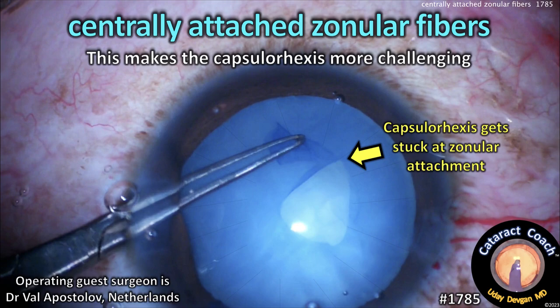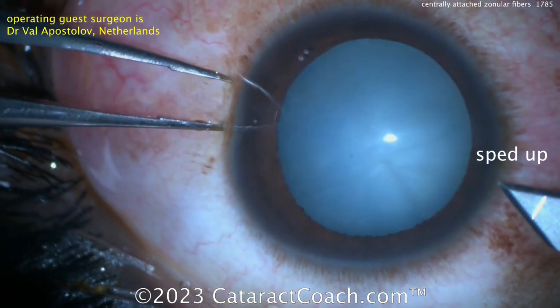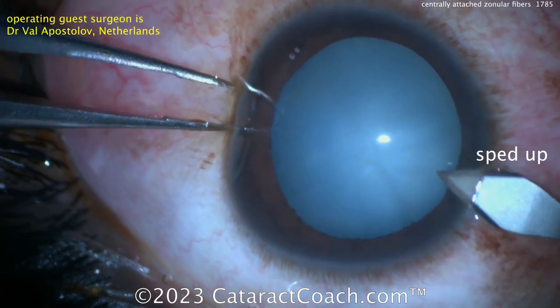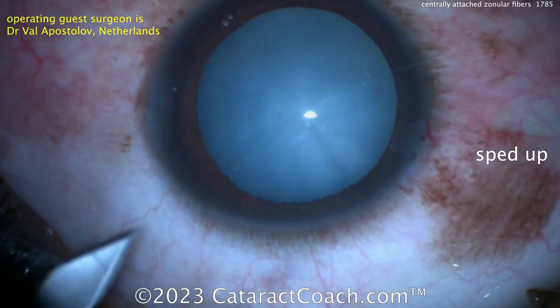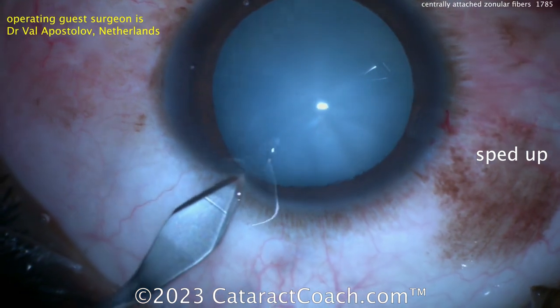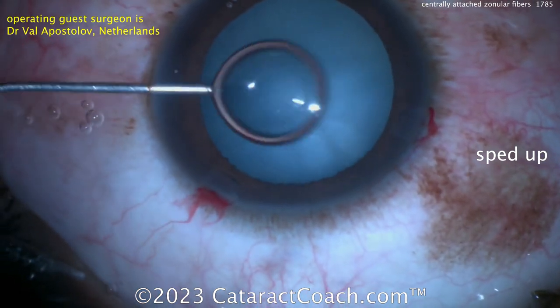CataractCoach.com. This case features centrally attached zonular fibers, which makes the capsulorhexis more challenging. You can see the capsulorhexis is getting stuck at the zonular attachment sites. Our guest surgeon is an expert, Val Apostolov from the Netherlands, making a few incisions here. This is an unusual thing — I've not seen many patients with this condition.